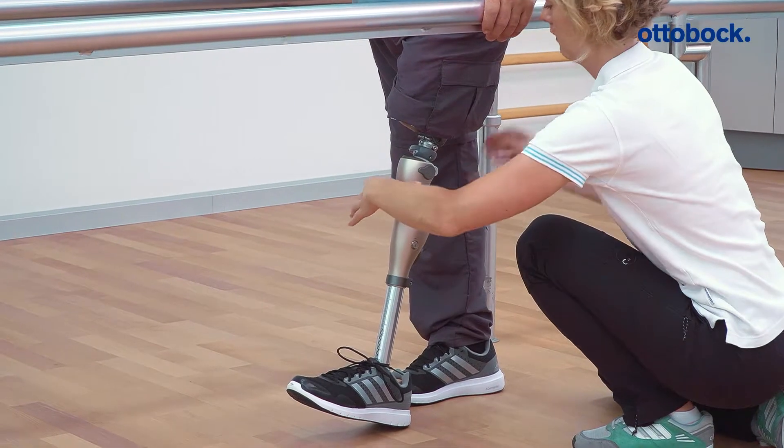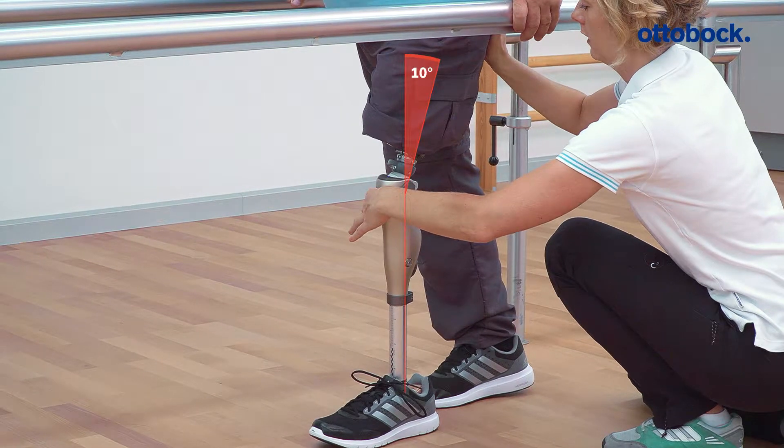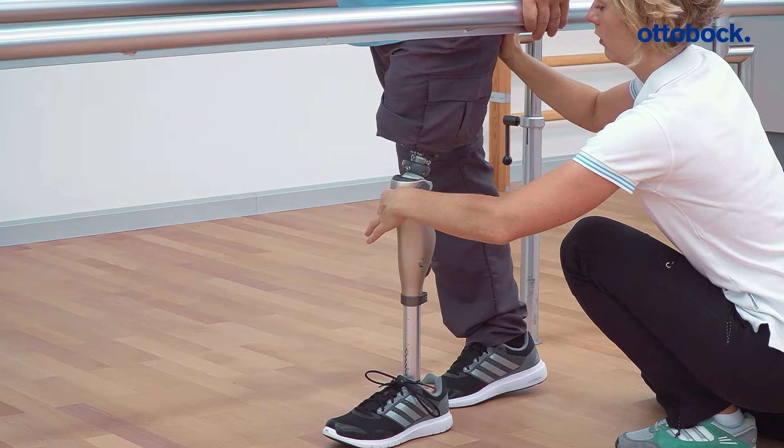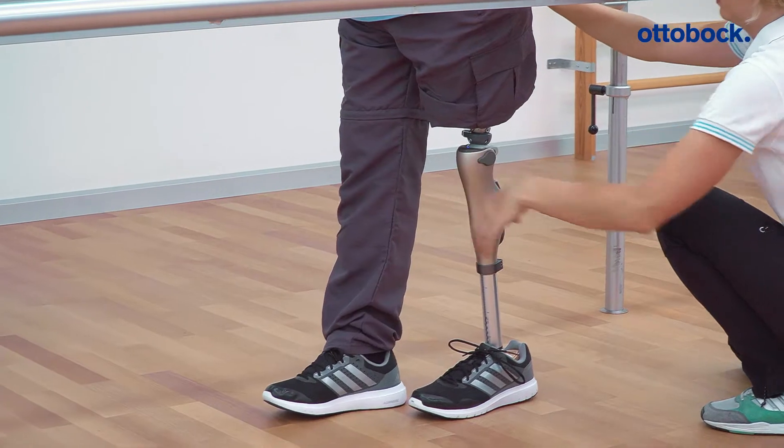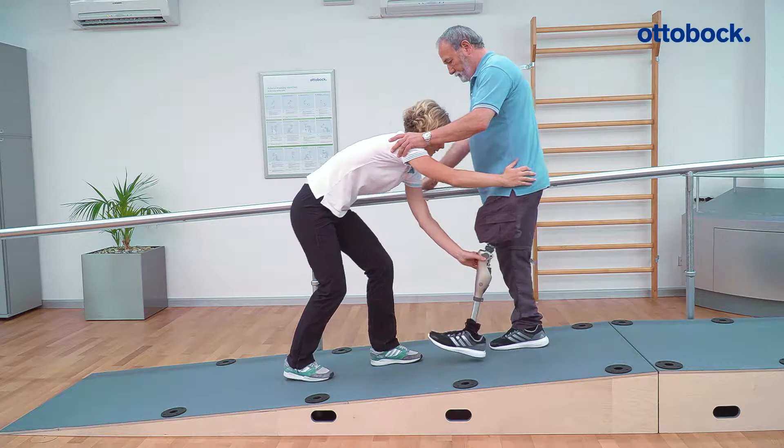In activity mode B+, stance phase flexion of up to 10 degrees is possible. This supports secure, full-foot contact on level surfaces and allows the user to navigate shallow slopes.